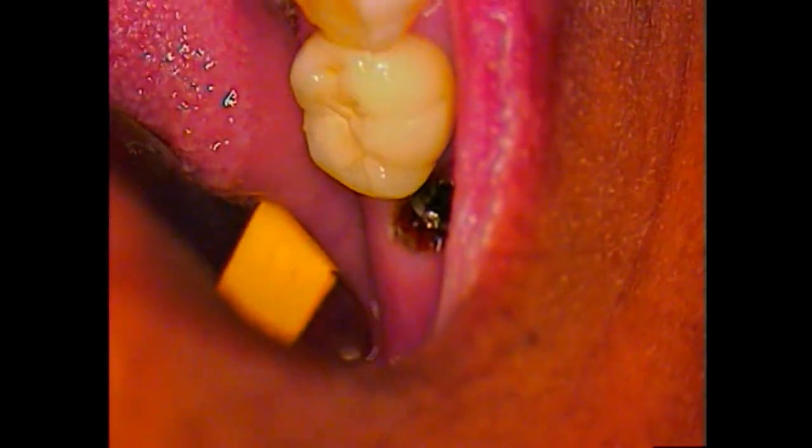If we zoom in, you'll see the exact component. You can see there's a hex configuration. If I just take any instrument — like a scaler — I can actually move the screw head; you'll see the screw shaft move. That's very mobile. So it won't screw out unless we can get what's holding it in out of there. It looks like cement of some type. First thing I'm going to do is just check to see what is holding it in.